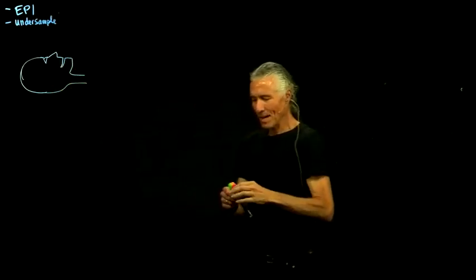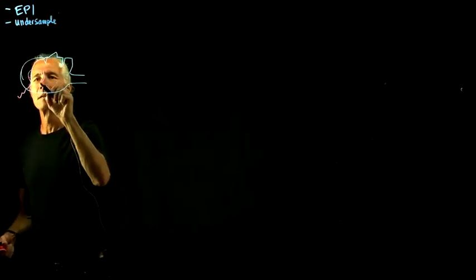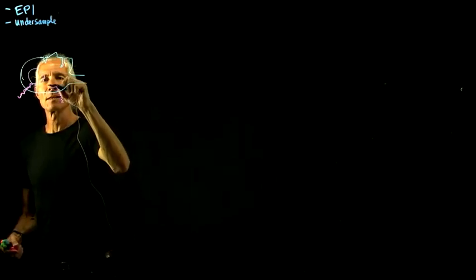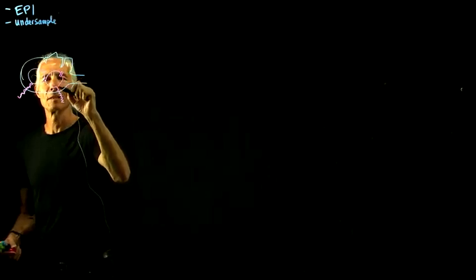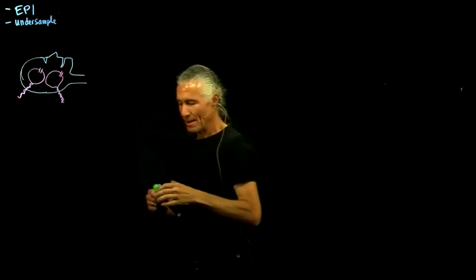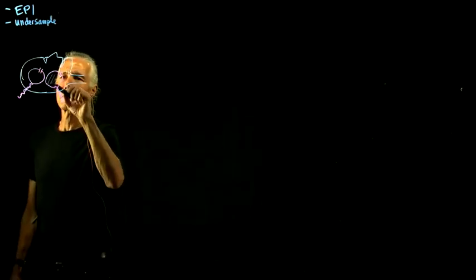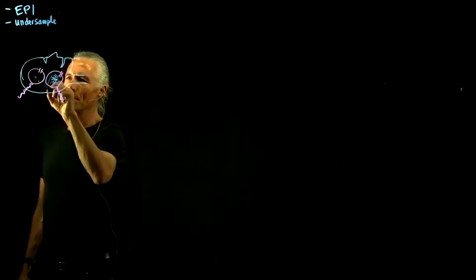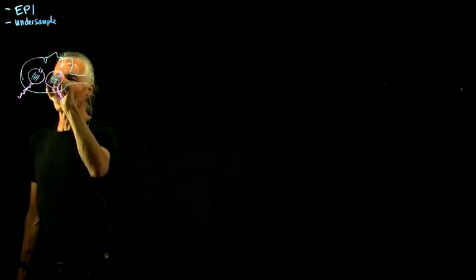And if you have one coil over here, and then you have another coil, say, over here, it's got a capacitor in it. You imagine this coil over here is going to pick up really well from this part of the brain, and less from the other part. It'll pick up the whole brain, but it's going to have a bright spot because it picks up better from this part.